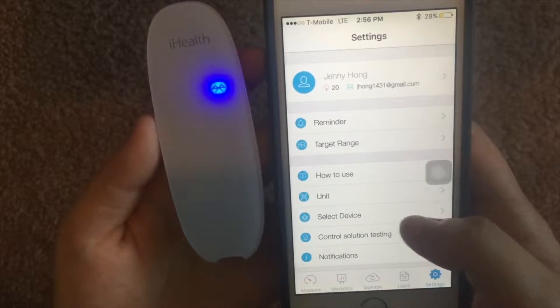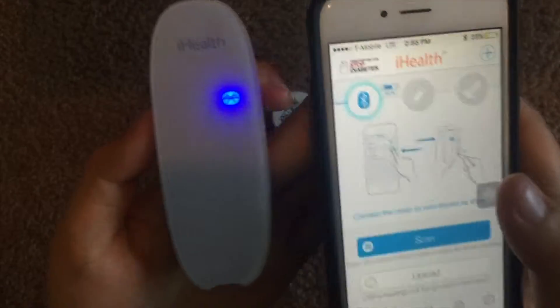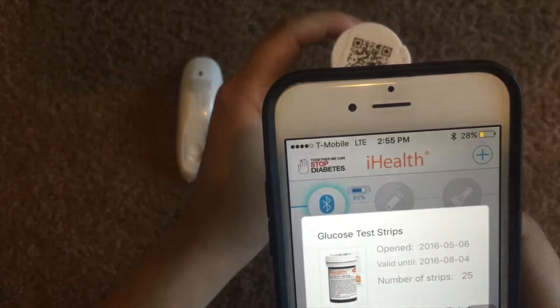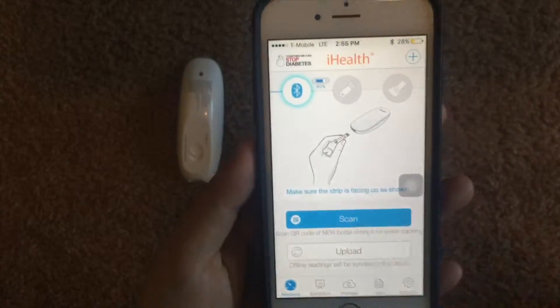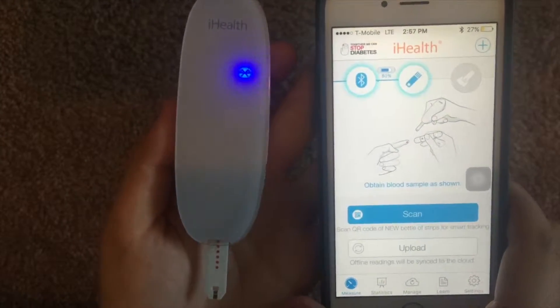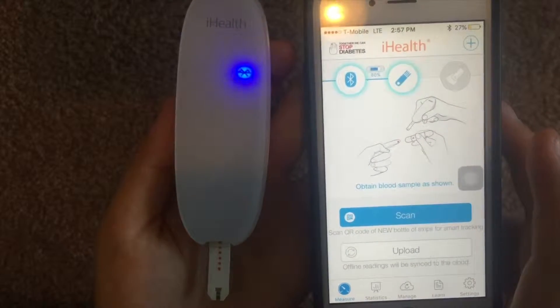The final button is for the settings of the device. After Bluetooth connection, the app then requires the user to scan a QR code of the iHealth Glucose Test Strip vial. We can then go ahead and insert one of the iHealth Glucose Test Strips inside the device. This tells the app that there is one inserted, and the user can now obtain a blood sample and get their glucose level readings.